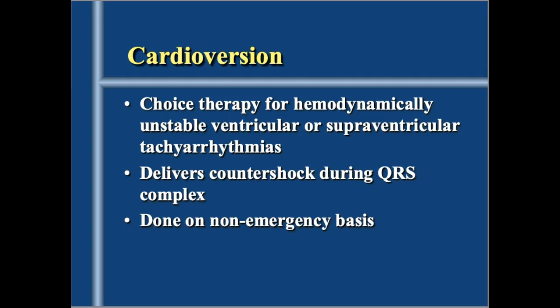The one thing about both cardioversion and defibrillation is that you only do them when you have a rhythm. You will see on TV that they'll defibrillate asystole all day long on those television shows. That's completely wrong. You don't defibrillate when you have no rhythm. Your reason for defibrillating is to stop the rhythm that you have so that the heart can take over and start again. So if you don't have a rhythm at all, there's nothing to defibrillate or cardiovert. So just know that's a misconception I see a lot just from television. They defibrillate everybody. It's scary.